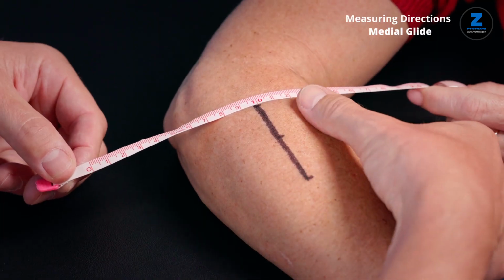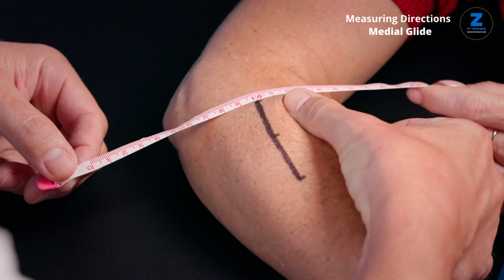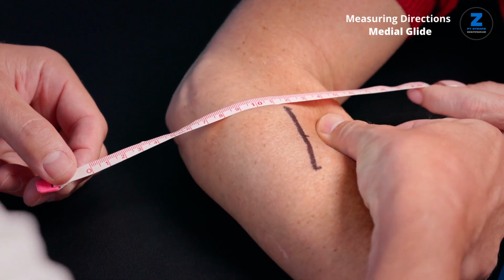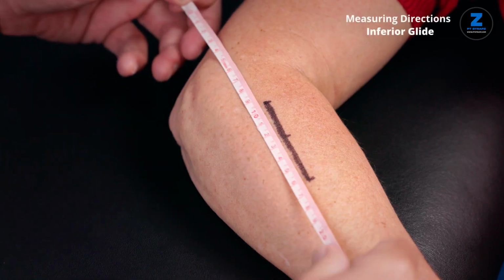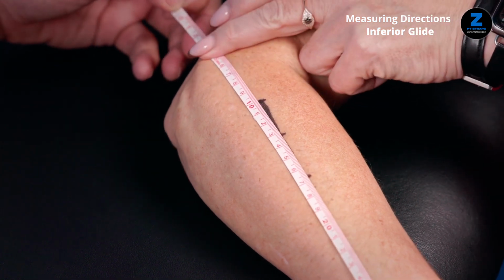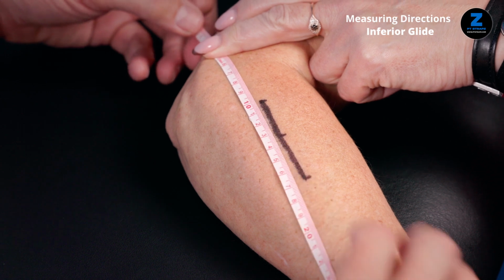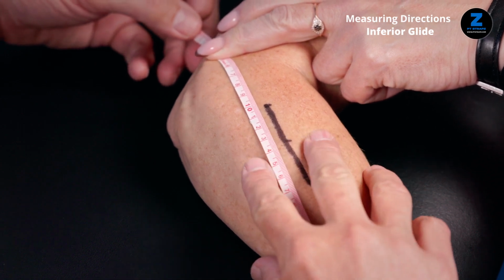And then we're going to go medially. I'm going to pull it over and pull. You can see, let's say a solid 1.5 centimeters for a medial excursion. So now that's our medial and lateral, and we're going to do superior, inferior. Hold it right there. Okay, so now I'm going to pull inferiorly.